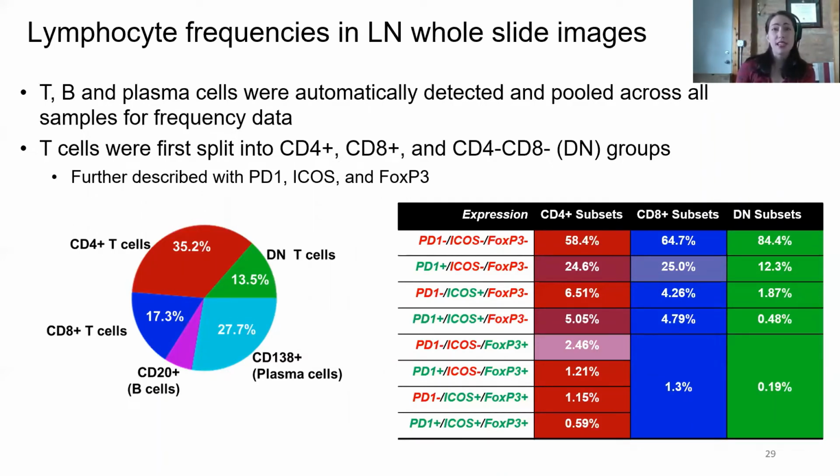We have our CD8 exhausted T cells, defined in the light blue in the second column. And we also have T regulatory and T follicular helper cells highlighted in the CD4 positive column in those different shades of red. So we can identify more specific types of T cells within these images as well.